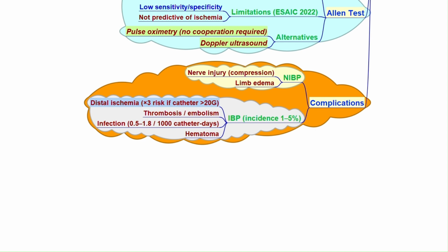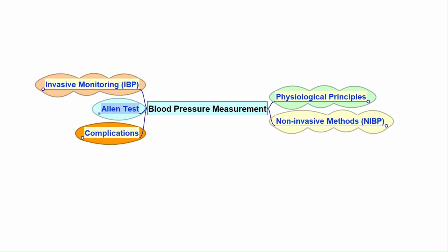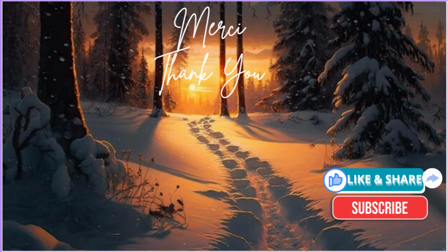In summary, non-invasive monitoring is generally safe, but has minor drawbacks. Invasive monitoring provides accuracy and continuous data, but carries risks that require vigilance and good technique.